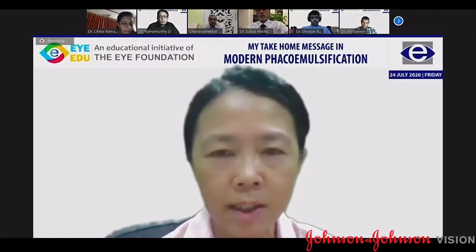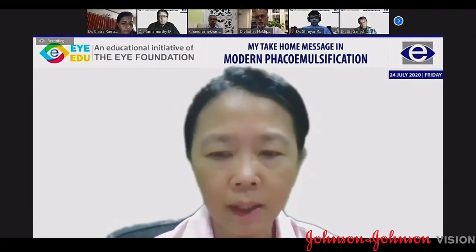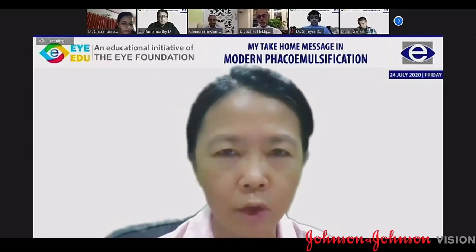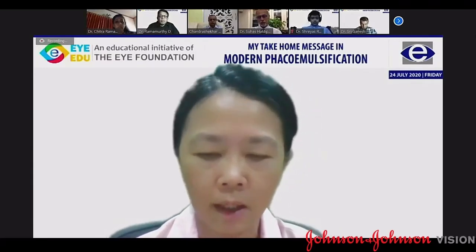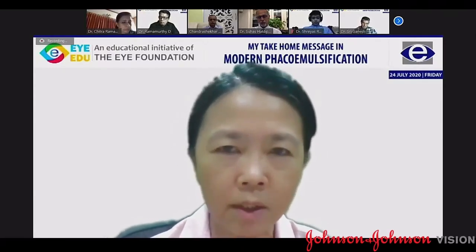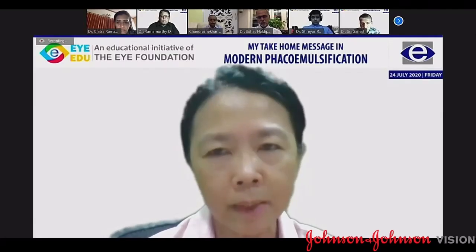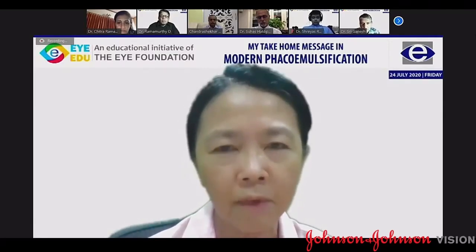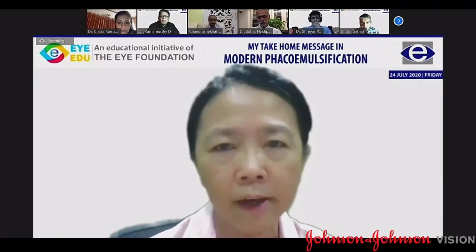You can actually adjust the lens position and so on. So I think that if the patient has got any kind of ocular surface disease, any kind of dry eye, definitely all these need to be treated. If you check the eye later, you have some cornea staining, some punctate erosions, all this actually would require pre-treatment, and you need to explain to the patient that this is very important, because if you want to get that perfect outcome, acquisition of the raw data needs to be really very, very accurate.